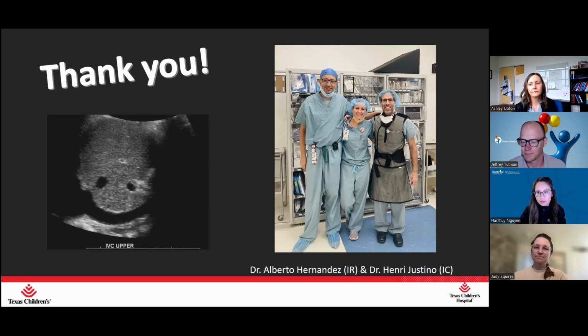Okay. Thanks. And I don't know if you already mentioned it, but is the technique similar to the liver, where you measure within a centimeter of the liver capsule? Yeah, you avoid the capsule. The spleen is so much harder than the liver, to me anyways, for elastography, because it's just a smaller organ to try to get that box into. And so it's hard to avoid the splenic capsule. So yes, you're supposed to still avoid the splenic capsule when doing the spleen, but I find it to be way more difficult because it's just one little area to try to get to. It's difficult. But yes, the same rules apply to the spleen.